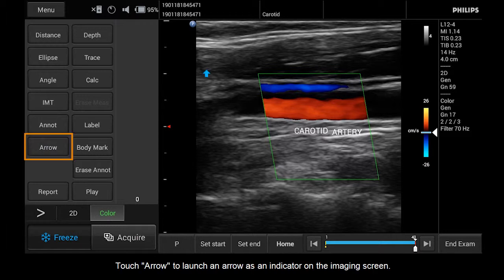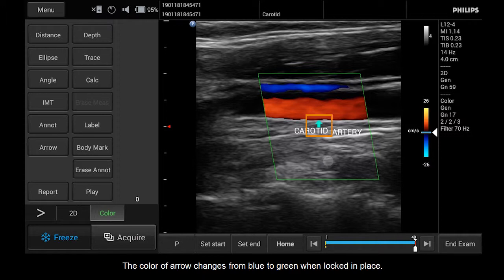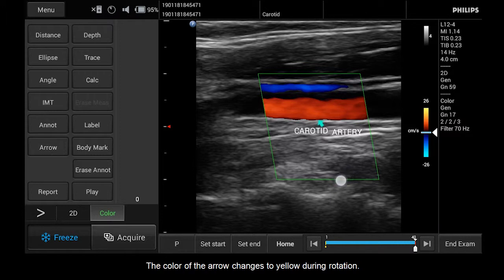Touch Arrow to launch an arrow as an indicator on the imaging screen. Press and hold while dragging the arrow to position it on the imaging area, then release to lock in place. The color of the arrow changes from blue to green when locked in place. Press and hold while moving in a circular direction to rotate the arrowhead. The color of the arrow changes to yellow during rotation.